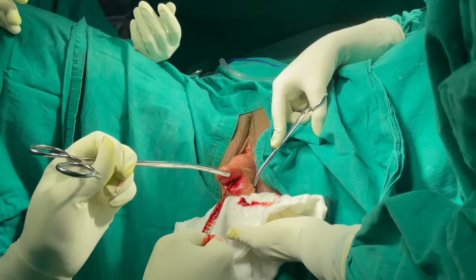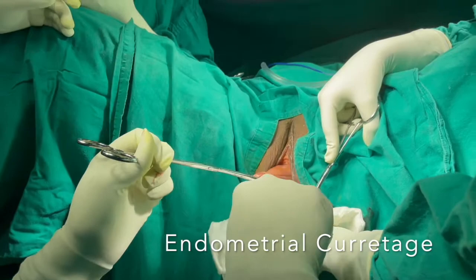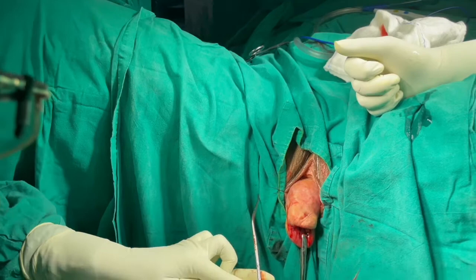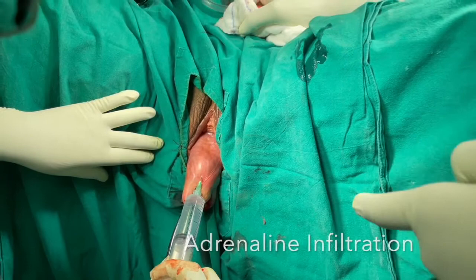Pre-operative dilatation and curettage is an integral part of Fothergill surgery. After adequate dilatation, the endometrium is thoroughly curetted. Thereafter, the length of the uterus is noted. This is called uterocervical length — it is the distance from the fundus to the external cervical os. In this case, it is around 12 cm and I have decided to remove around 5 cm of supravaginal cervix.